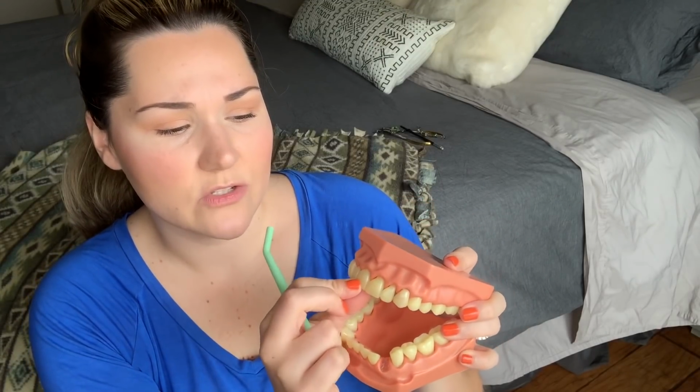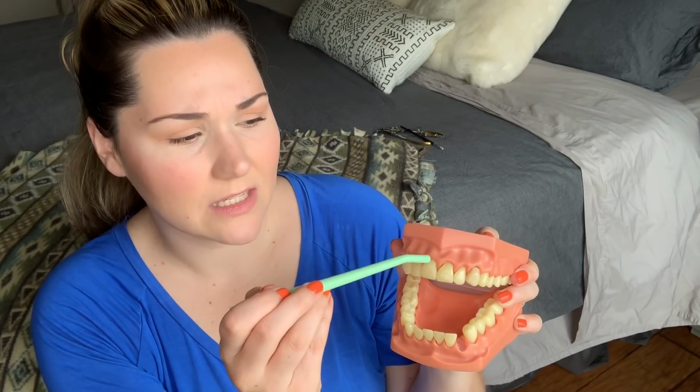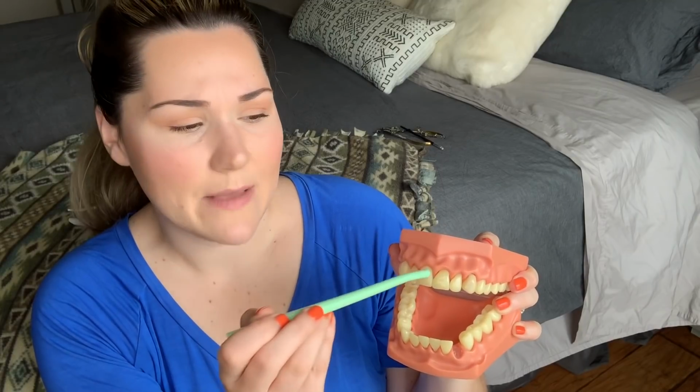So again, we'll do the surgical one. Say we're extracting number 8 right here, this guy. So you use your suction. The doctor is trying to loosen up this tooth. He has the forceps on it, he's just kind of wiggling it out. I use my suction, just kind of suck at the gum line. Just kind of dab it.